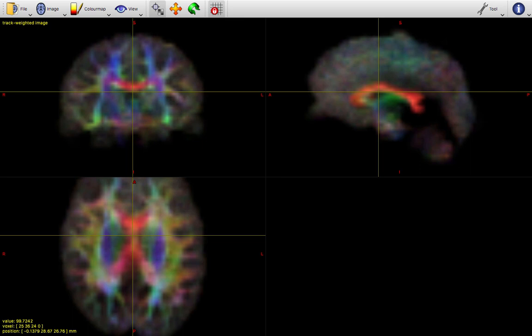You mentioned there's two types that you can choose to analyze, with the option of pathological tissue types. How is the program identifying the different tissue types? Right. So with these weighted images, usually the different tissue types will have different intensities. And it tries to set different thresholds for, say, what's white matter, what's gray matter. It doesn't always do a perfect job, but they do it especially in FreeSurfer, for example. Any type of segmentation that you would do, they try to identify some sort of threshold. More advanced ones will try to use additional details about the anatomy to determine that. So you may have a relatively dark voxel in the white matter. But given that it's surrounded by white matter, it should also be white matter, so it should not make the mistake of misclassifying it.